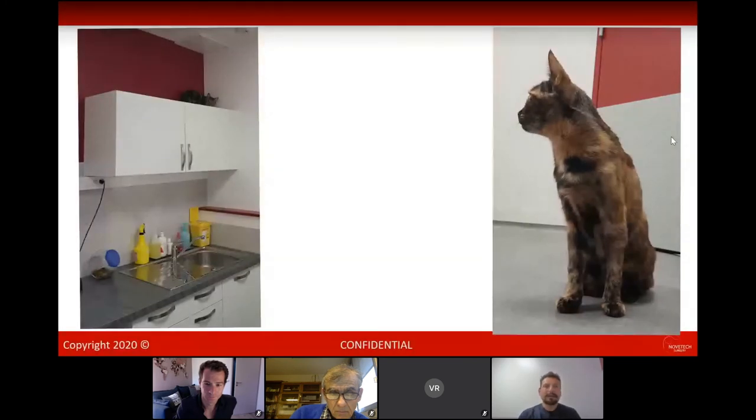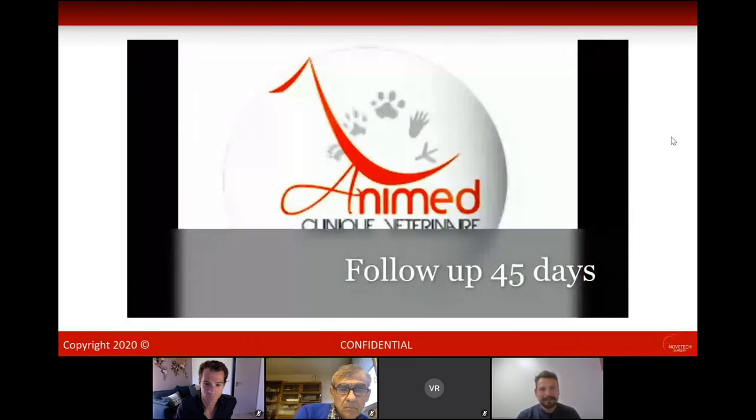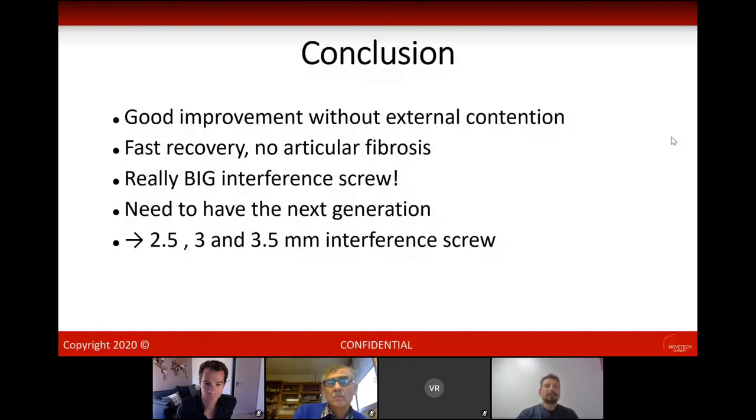So, as we said, we don't have any trouble and have a good improvement on the two cats. Next slide, please. Can you skip the video? Yes. In conclusion, we did have a good improvement without external contention, and that was great because I don't like to immobilize the articulation. We had a fast recovery, that was good also. What was bad is we did have a really big interference screw. It's really huge compared to the size of the ulna. So we need the next generation. Please, Victor, give us the 2.5, 3 or 3.5 interference screw, and that will be great. Thank you for your attention.